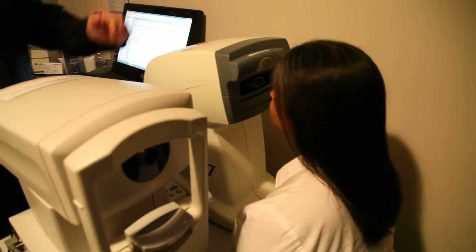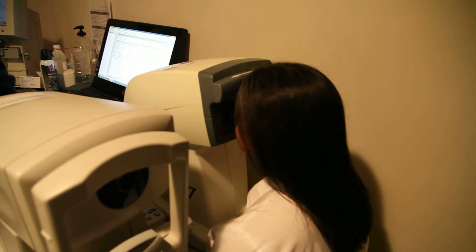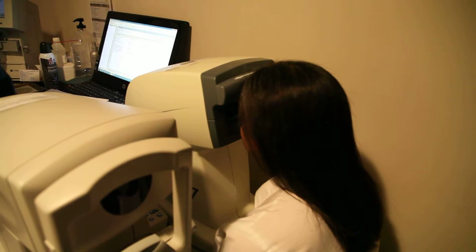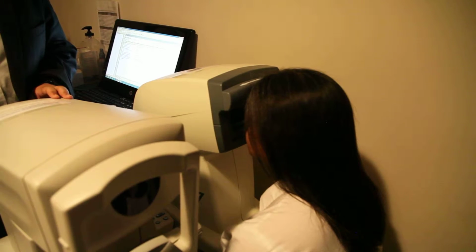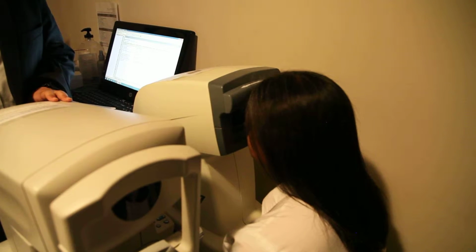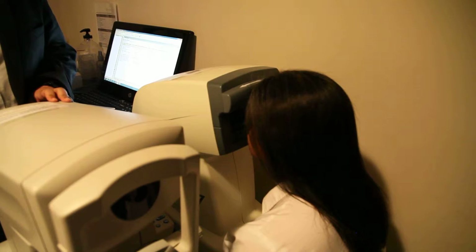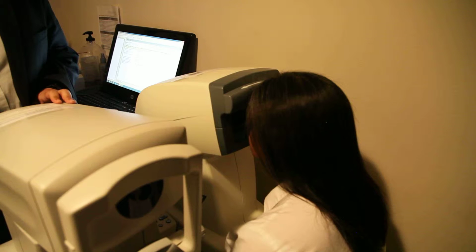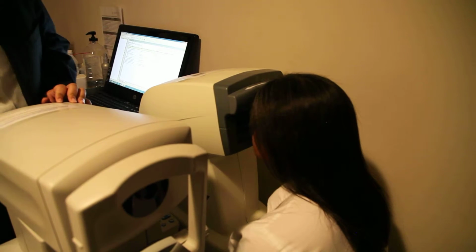Okay, if you will, go ahead and place your forehead all the way against the pad. Keep both eyes wide open. I'm just going to bring this down a little bit more. Alright now. So in just a moment you're going to see 4 red lights with a green light in the center. Let me know if you see it. And bring your forehead up just a little bit. Go ahead and bring your forehead up just a little bit more.